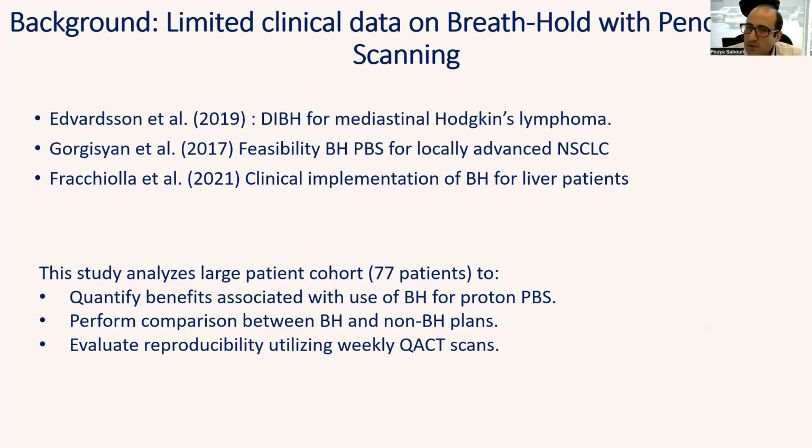In our study, we aimed to contribute by analyzing a large cohort of patients, about 77 patients, focusing on the benefits of breath hold with PBS, direct comparison between breath hold and non-breath hold plans, and the reproducibility over time of the treatment course using weekly or biweekly QACTs.